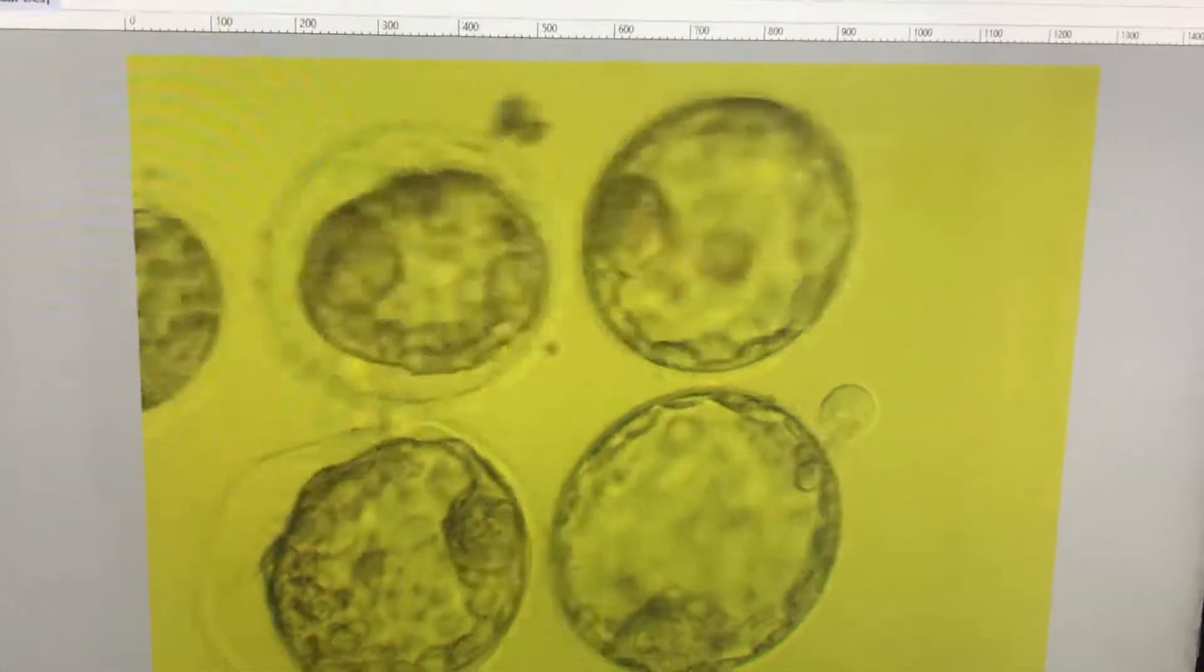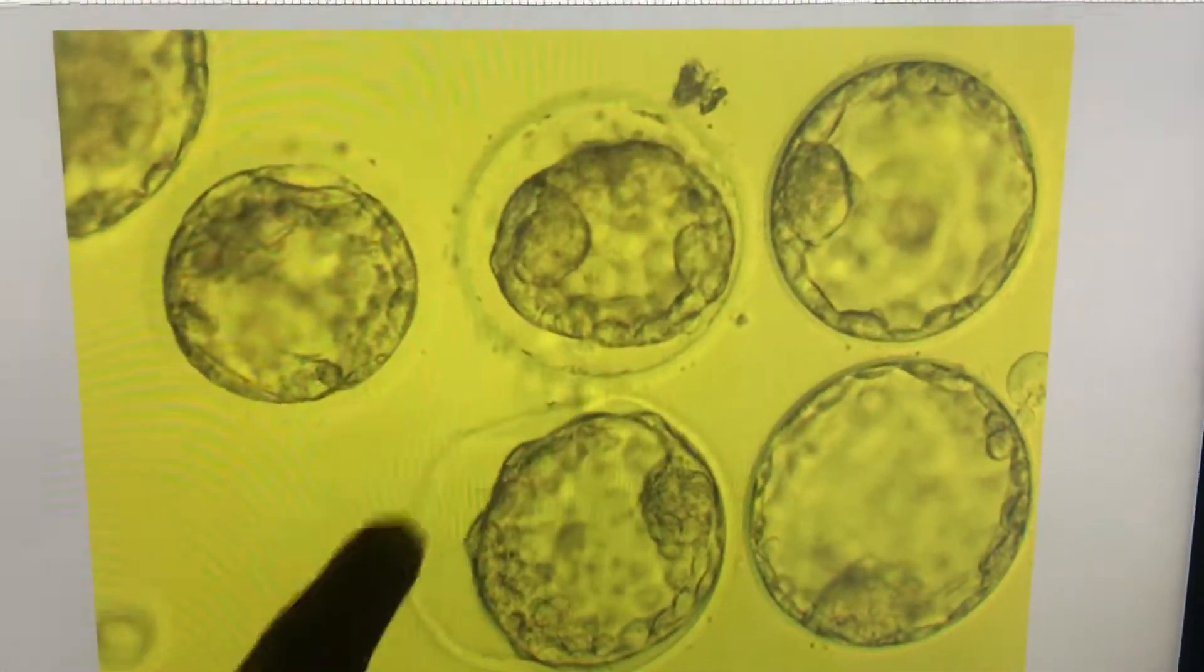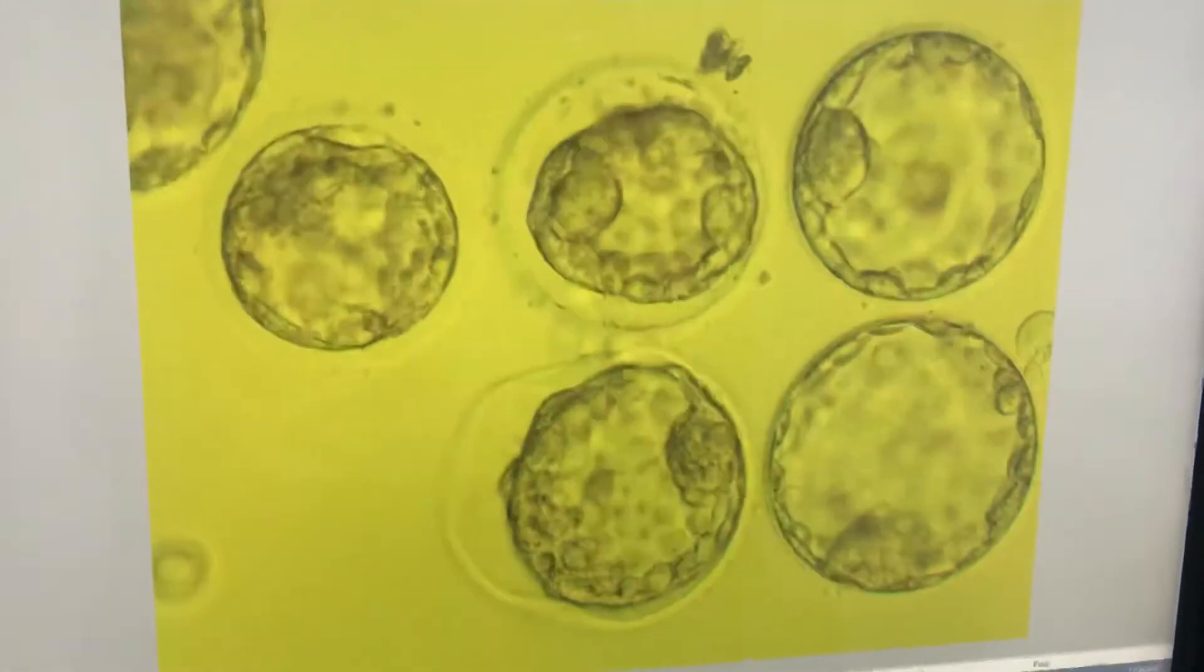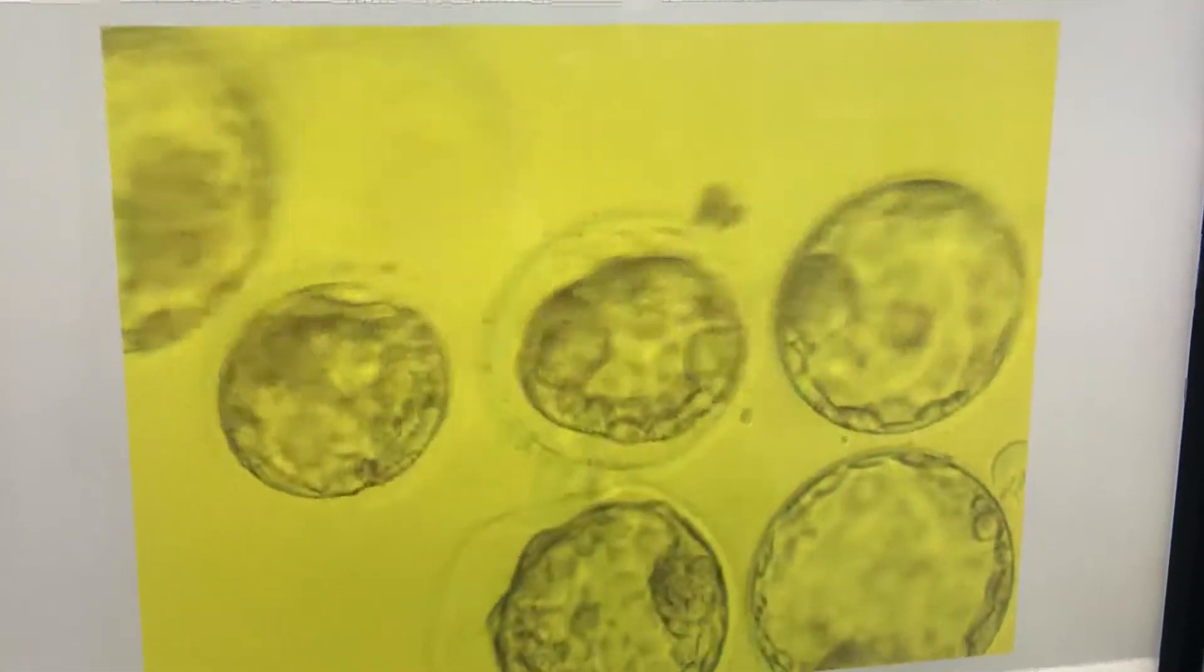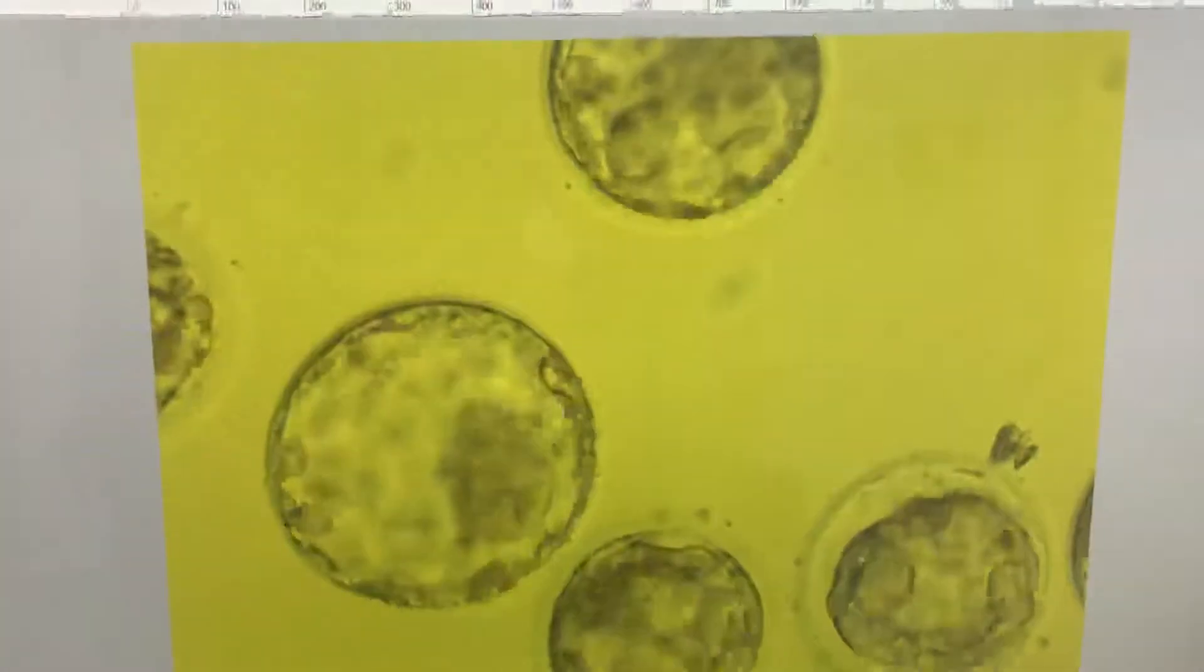5AA, 4AA. These two embryos are getting contracted. So this is a 3BB. And this is 5AA.